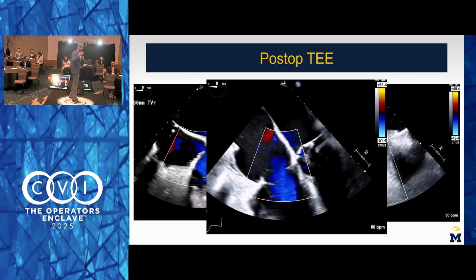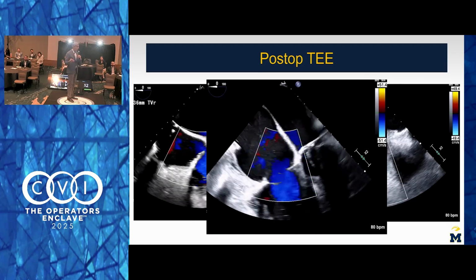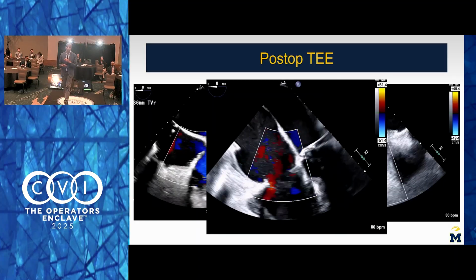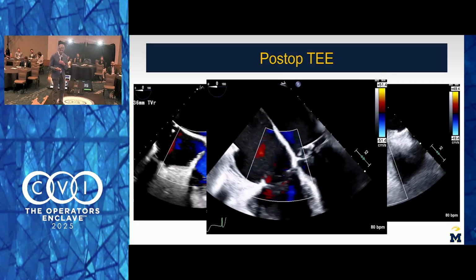So I think we're going to see, in theory, when we're downsizing, more remodeling of the RV than we do with oversized prostheses. So at least that's the hope.